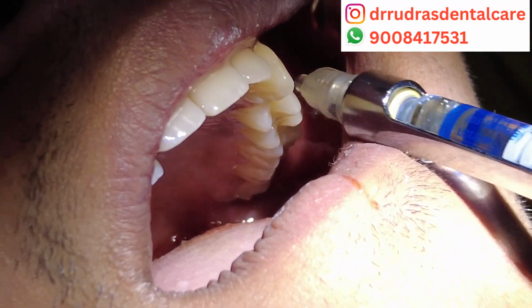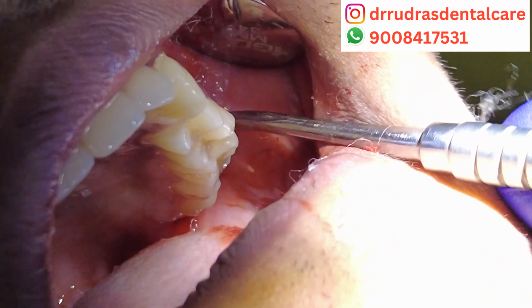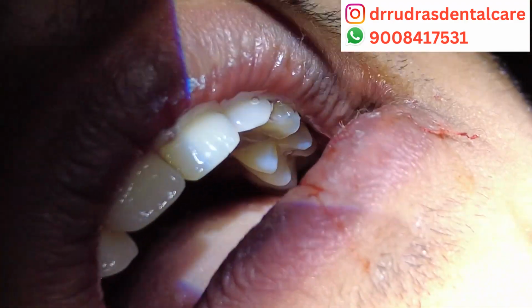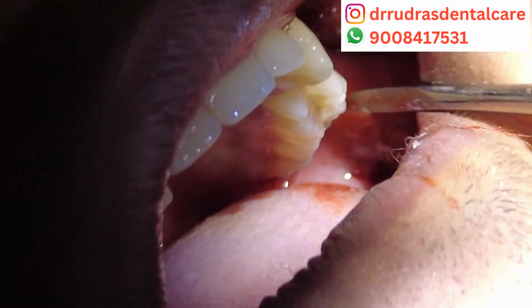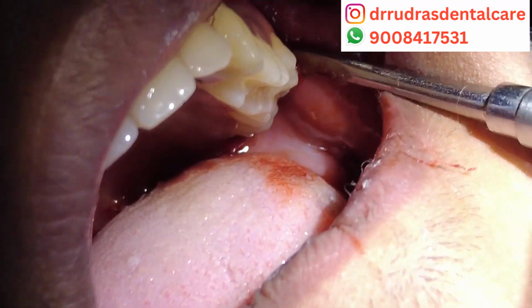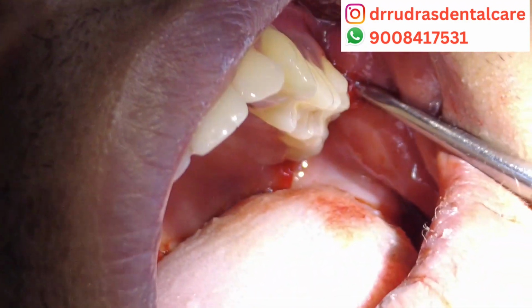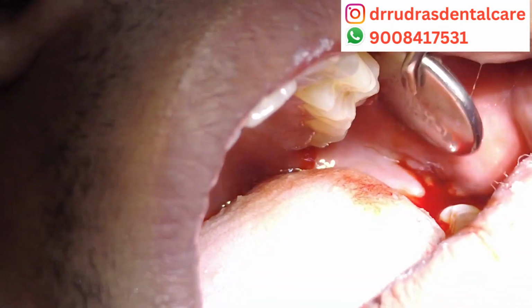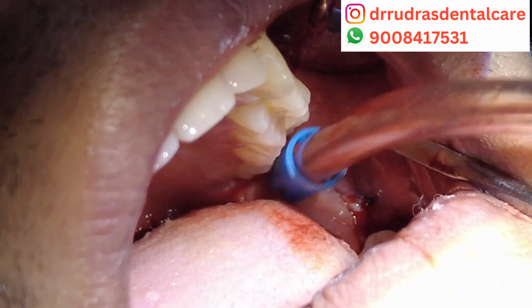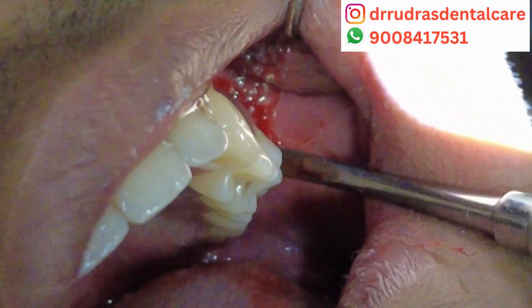And now we are starting to attempt the luxation of the teeth after the gingival fibers have been separated with the help of a periosteal elevator. And now we are separating further. We are going more apical to separate the fibers and try to raise the flap and elevate it, and then we will first attempt the non-surgical extraction, knowing that the teeth were impacted.